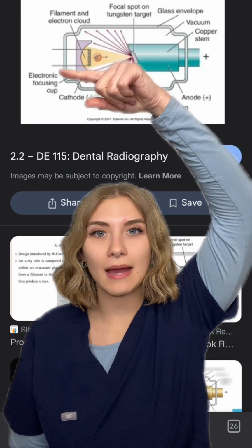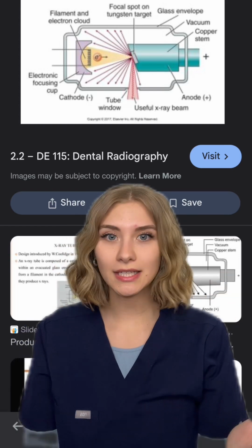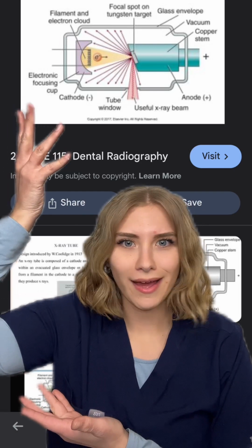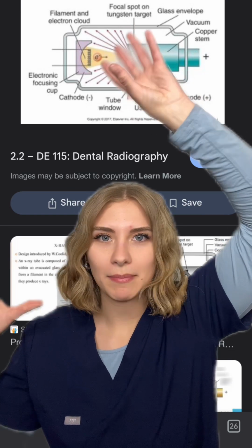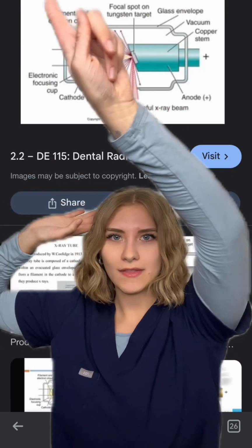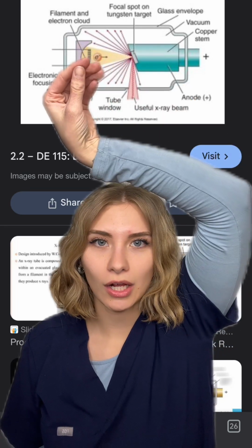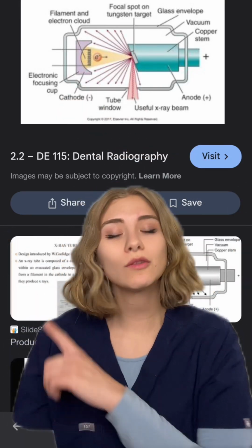But this doesn't happen when you hit the button. This is constantly happening until you hit the button, and that's when X-rays come out. What's needed is electricity. You need a power cord to the X-ray unit. Duh. It's constantly heated up, and there's constantly a big cloud of negative electrons. As soon as you hit that button to take that X-ray, boop, then all this negative electron cloud is heading towards this. But anyway, I digress. So back to the power unit.